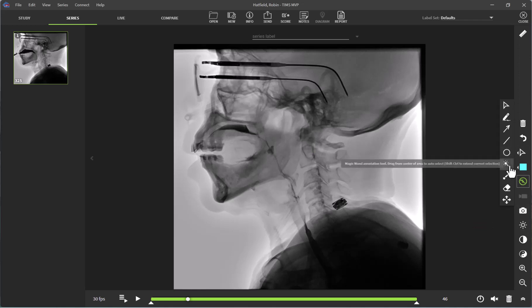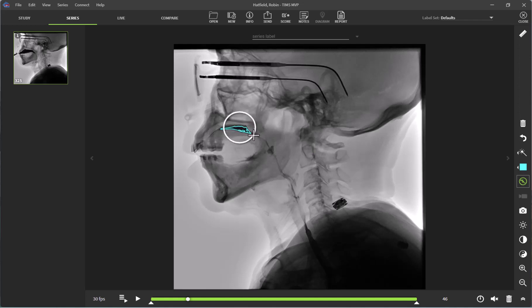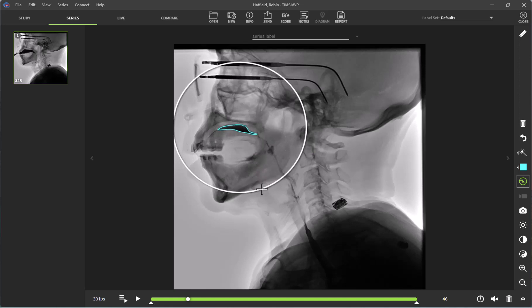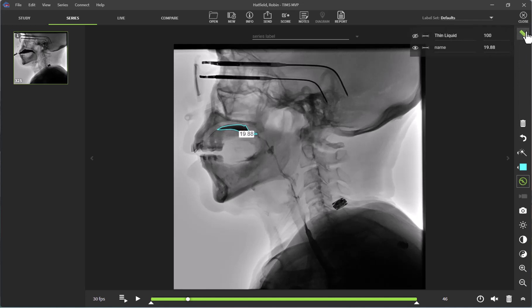I am going to go back and select my magic wand again. To measure this, I am going to click where the residue is and expand out. As you can see, my residue is now outlined. I am going to click on the measurement tool here, and this is going to show me the percentage of this residue compared to the original bolus that was set to 100%. We can see that this residue remaining is about 19.88%.